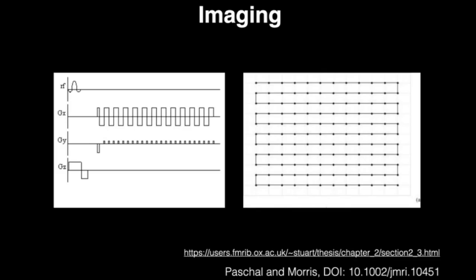So you stop at about this point in the sequence. But for echoplanar, because we want to run faster and capture the brain for fMRI much more quickly, we read out a lot of information in one go. And we end up traversing K-space in this type of trajectory. Okay.